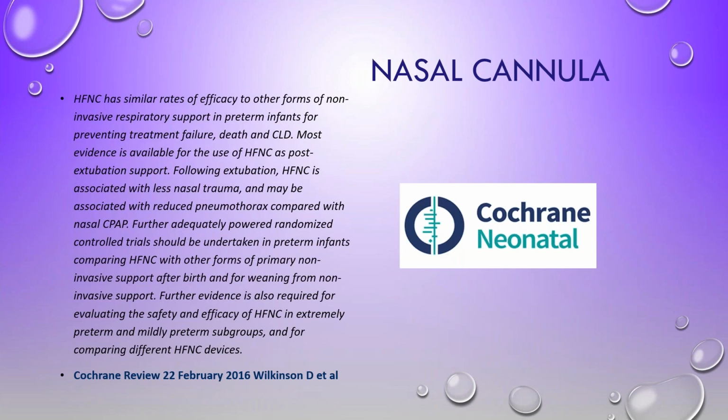In a recent Cochrane review, this is in 2016, and I'm going to quote: high flow nasal cannula has similar rates of efficacy to other forms of non-invasive respiratory support in premature infants for preventing treatment failure, death, and chronic lung disease. Most evidence is available for the use of high flow nasal cannula as a post-extubation support.